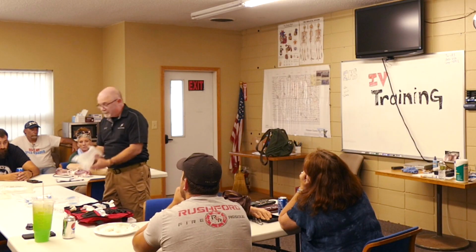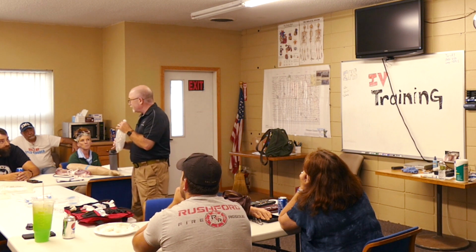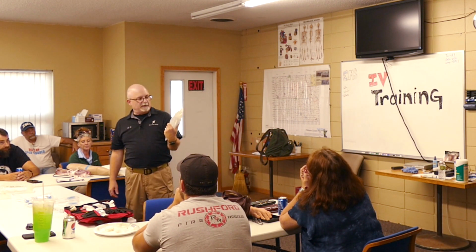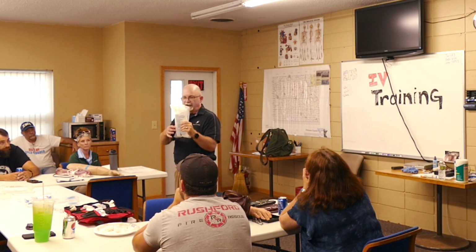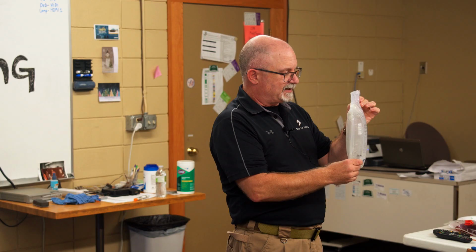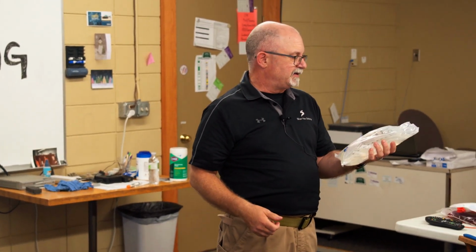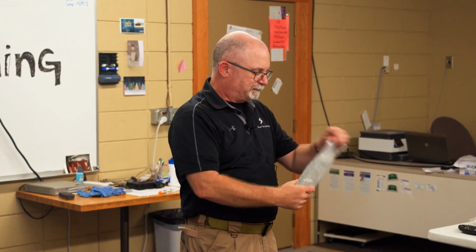But so, solutions. How many? You got cases of these, right? You got cases, good. So when we start, basically you want to make sure that you have the right solution. So we already talked about that, 0.9% sodium chloride. This outer wrapper is protective. It's just a protective thing to help keep them from getting poked. If for some reason it's not used, it doesn't make the bag expired, unless you guys are internally going to do that. But, you know, we took it out thinking we were going to use it and we didn't. It can go right back in.